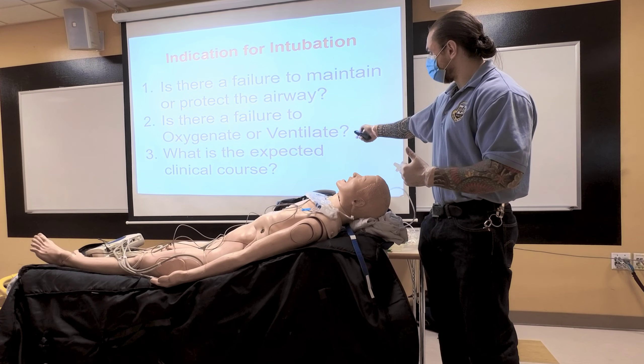After we do our ABCs, we're going to start to ventilate. We're going to start to perform BVM ventilations. We're going to place the patient on the monitor, on the pulse ox, and place this end-tidal CO2 adapter in between the BVM and the monitor. Every time I squeeze the bag and the breath goes in, I see the waveform in real time. The number here is 35. The pulse ox number has a lag feature — if the patient has bad hemodynamic status or low blood pressure, this number is in the past. So if you see 90% saturation, that may be three minutes ago and their actual saturation now is like 76.